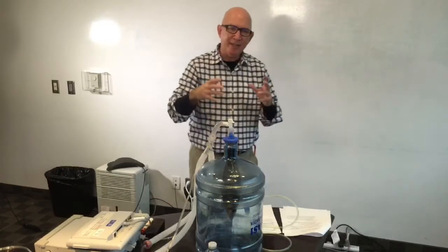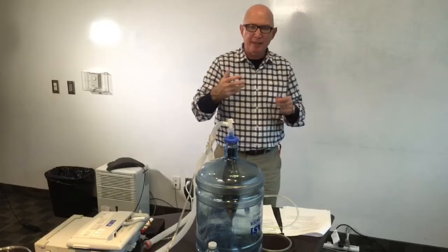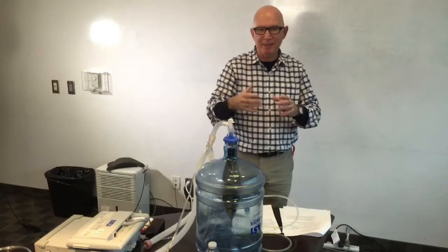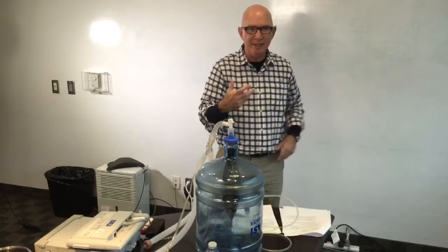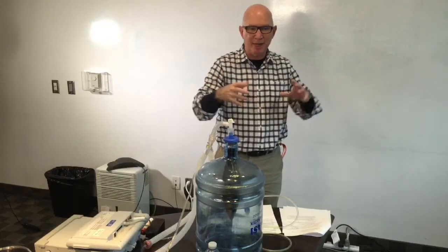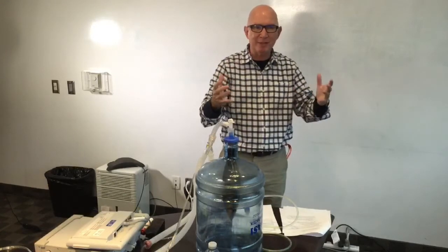But let's take it back to someone who has healthy lungs. If you set your ventilator up correctly, it shouldn't take any more pressure to expand the healthy lung of a morbidly obese patient than it does for someone who's a regular size. The difference is that you'll need more PEEP, to counterbalance the pressure that's on the lungs during the expiratory phase, which will have a tendency to try to collapse the chest.